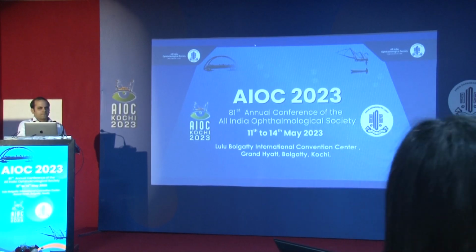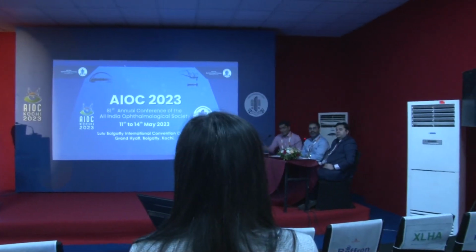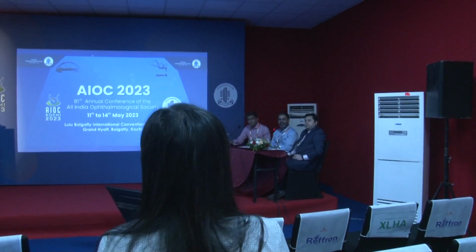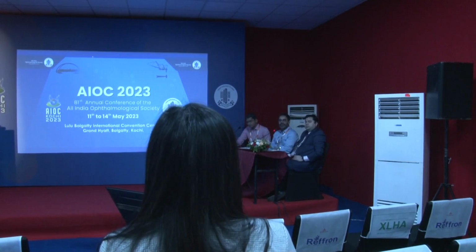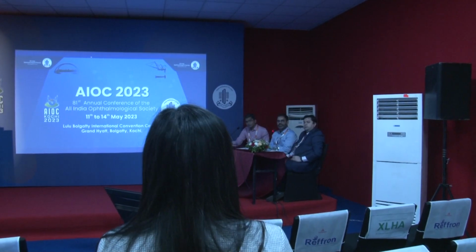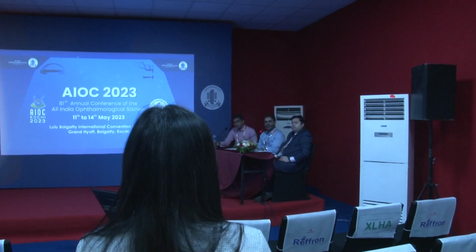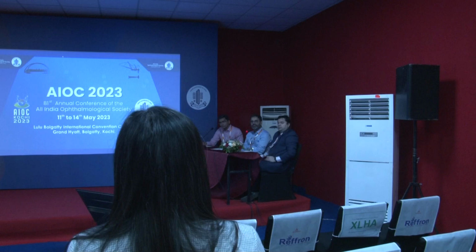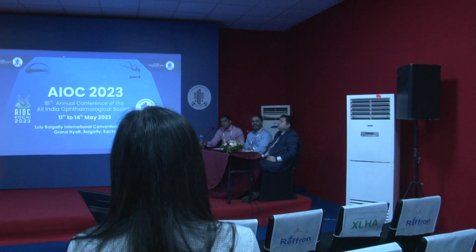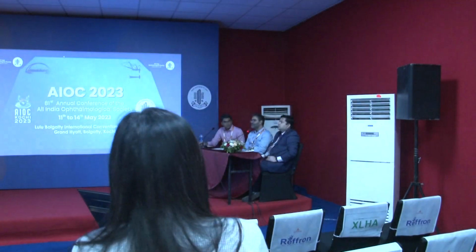I was just wondering about the macular hole that was present, which I guess, as you said, means ILM peeling would probably not have been the best idea. But what do you think is the mechanism here of the closure of the hole? Because the hole probably was created after the PVD, since we could not see it on the OCT. So what is the closure mechanism here? Did the gas help?